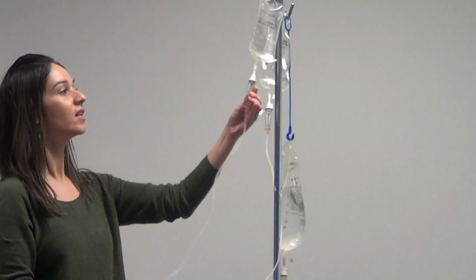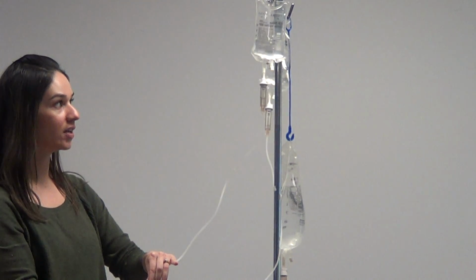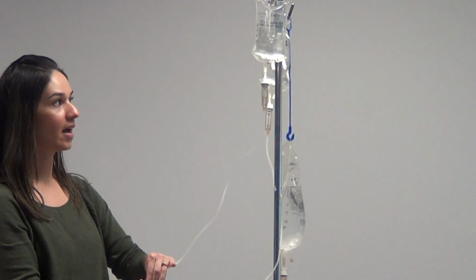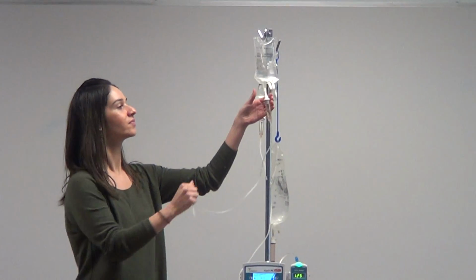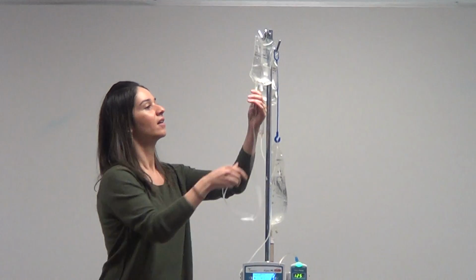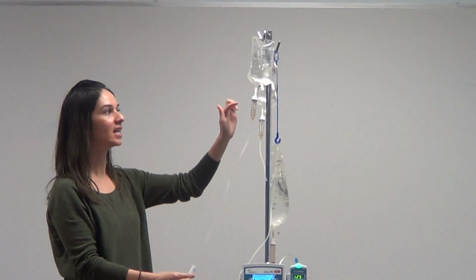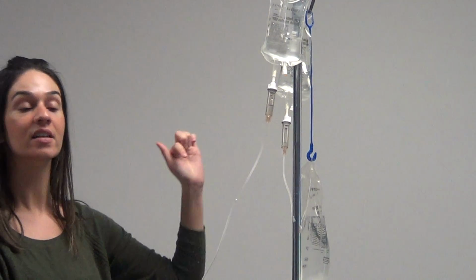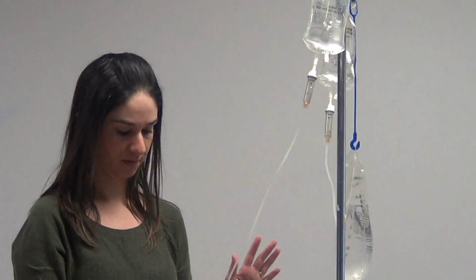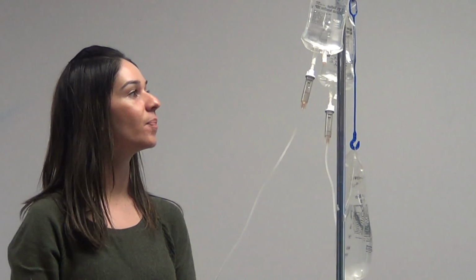Literally, the nurse, do you see by this little dial, they turn it, and if it works, that's not going. So we count per minute the amount of drops that goes into this chamber, okay? That's called by gravity. We don't use the pump at all. What do you think is safer? The pump. The pump is safer.